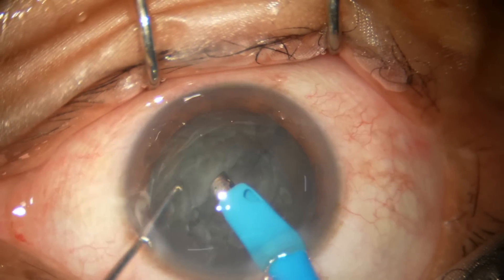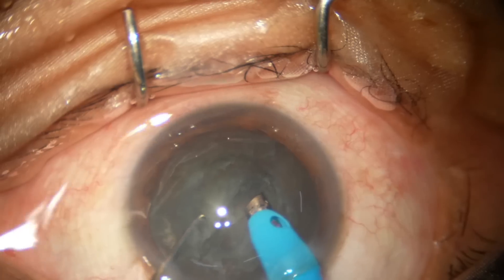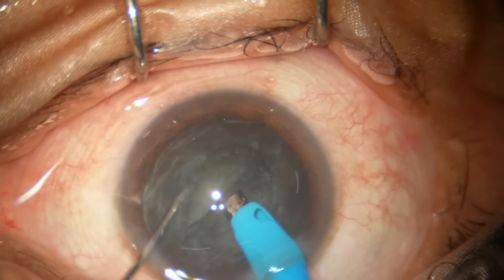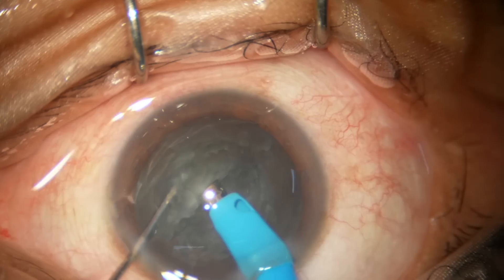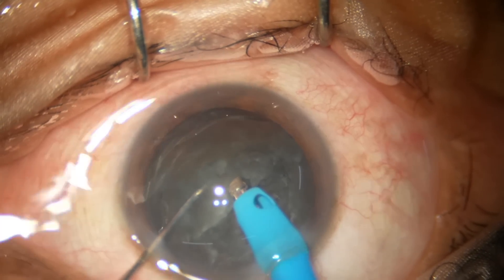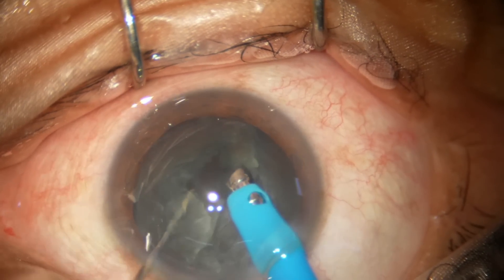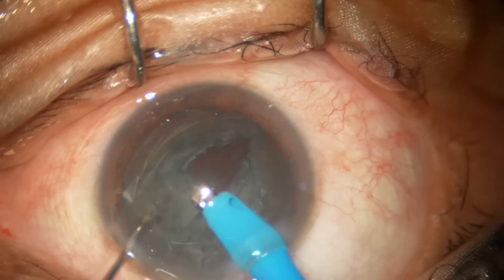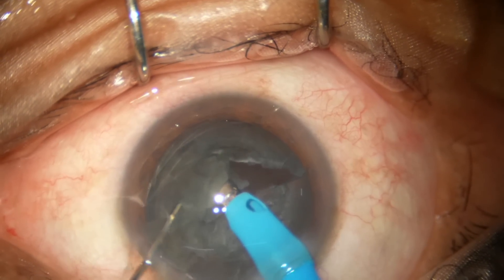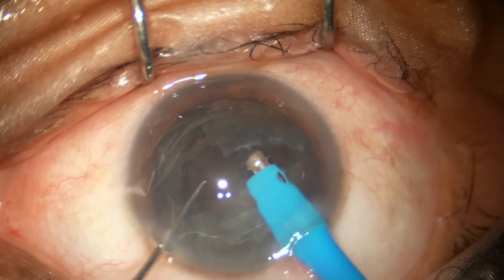Now I go to higher vacuum — increasing to 350, 400, 400, 400. I am now using 400 vacuum. I hold this piece, chop it, and emulsify this fragment. Now I come to the other fragment, hold it, bring it to the center, and emulsify it.